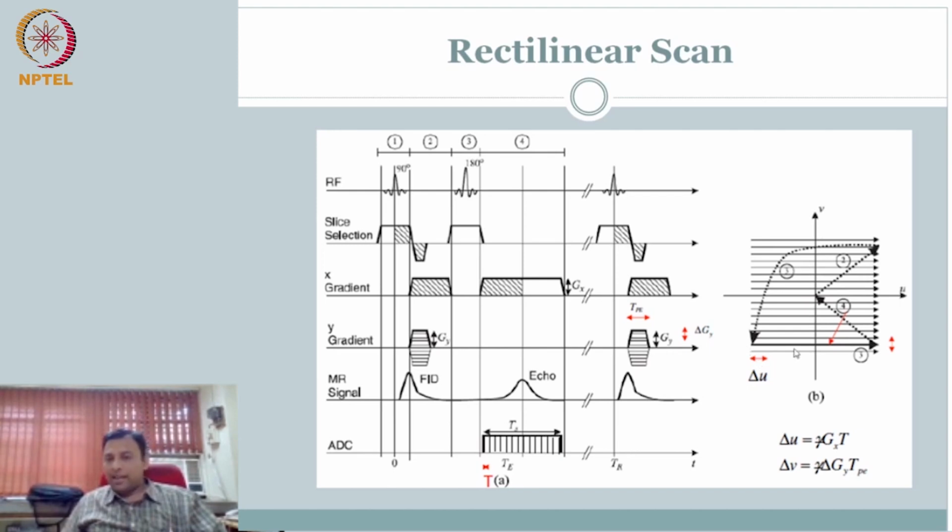So we have been putting this arrow line, but more correctly what we should have put is a sequence of dots, and the distance between two dots or two samples would have been delta U here. In this direction it is intuitive. We always put discrete steps. Okay, so this is what we have.